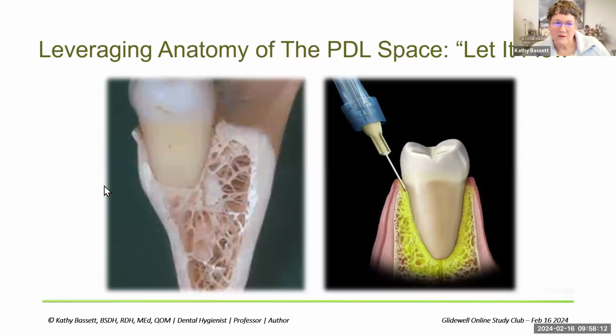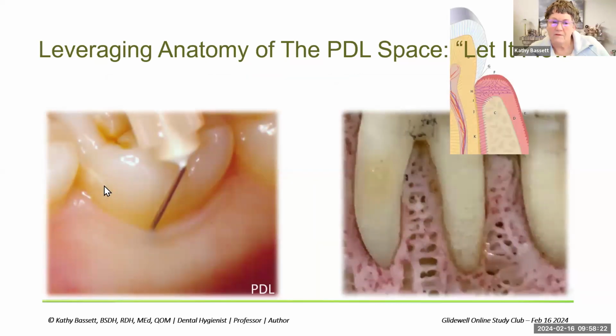So to start, the injections for osseous targets, these are very effective. Just remember, drug moves through spongy walls easily. Your visual cue on this one is be sure you see blanching. This is going to tell you you have an appropriate location, and this is going to tell you you have an appropriate volume of anesthetic. And just remember, it's going to flow through all that cancellous bone.